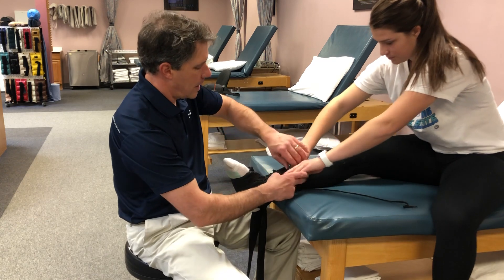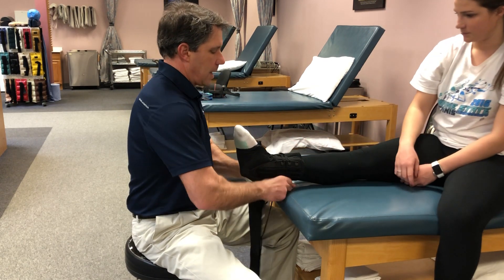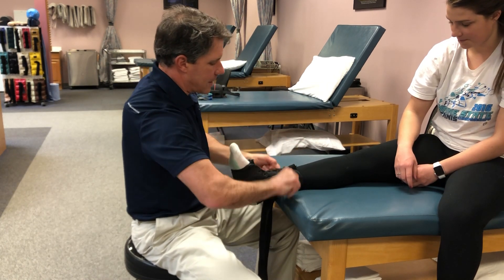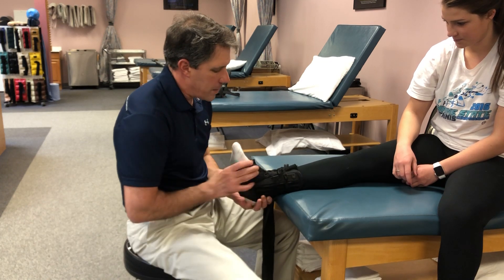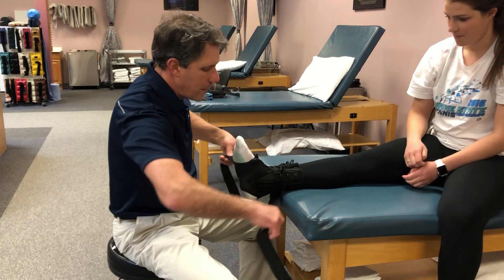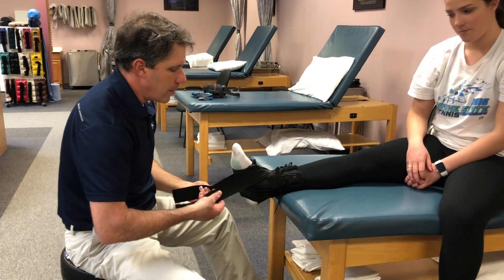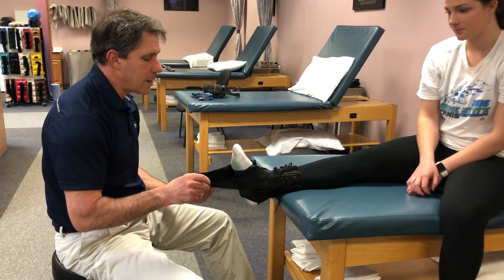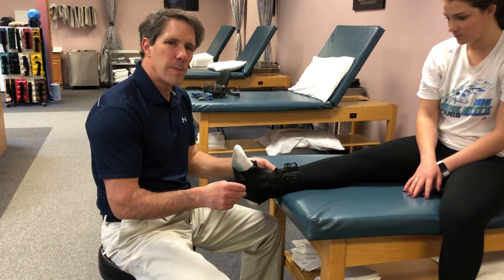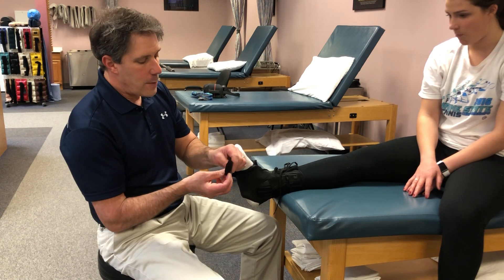We'll go ahead and tie this right up — just the top. This brace is a little big because I didn't have one in her exact size, but we can make do for today. I like the lace-up part because it gives good stability side to side while the foot can still rock a little bit. I really like these figure-eight straps: we take them and crisscross over the top, then crisscross underneath. On the outside strap, I just put the velcro on there — snug but not too tight — while the foot is in a neutral position.